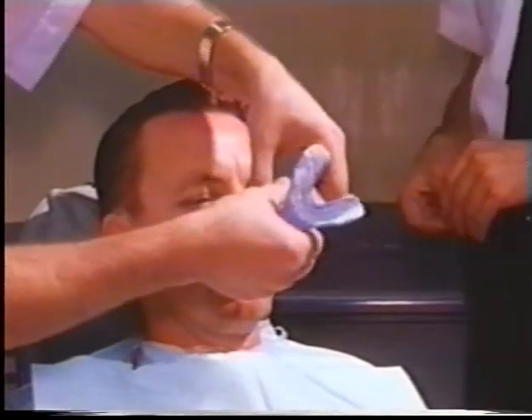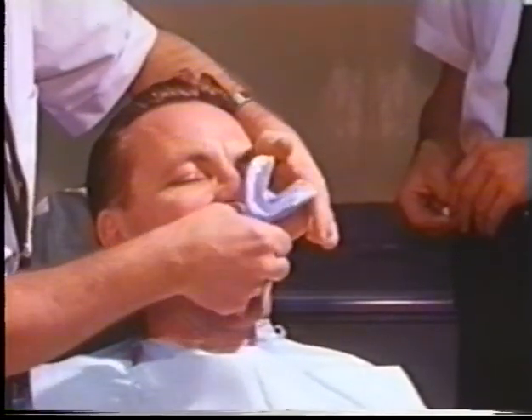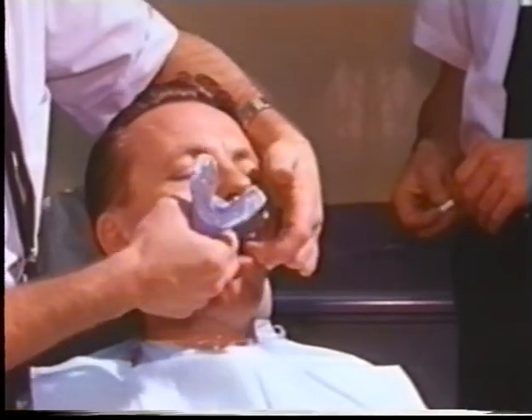The clutches are cemented over the subject's teeth with a zinc oxide and eugenol impression paste.